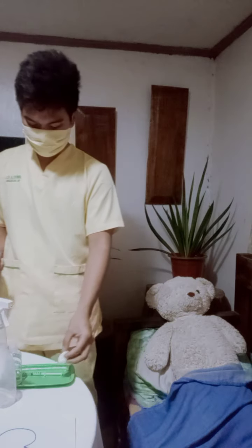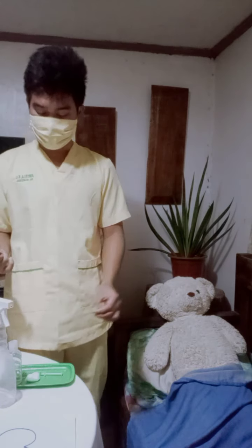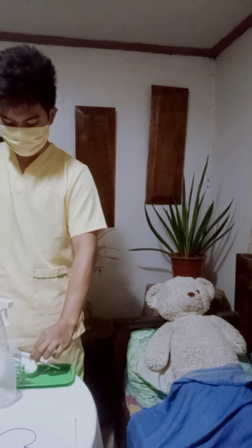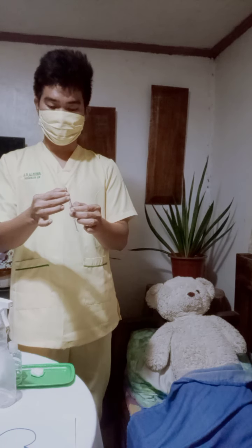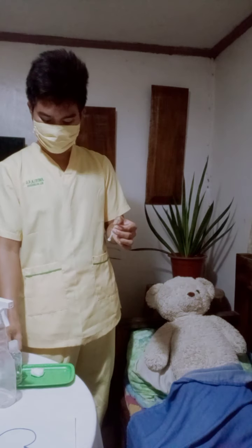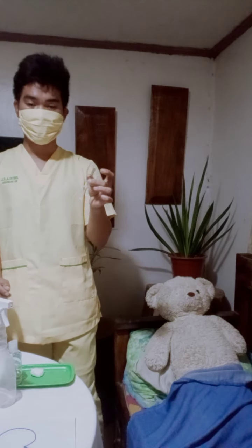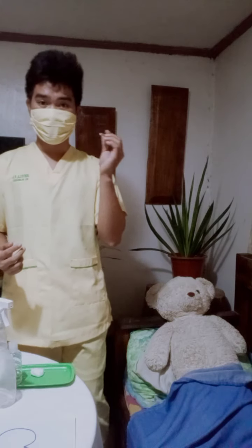Then we're going to do that and then get the syringe. We're going to remove the cover or sheath of the needle. Make sure you remove it accurately to prevent needle stick. It's very important because it's very dangerous, because it's a needle. And then we're going to hold the syringe like a pencil, just like this.